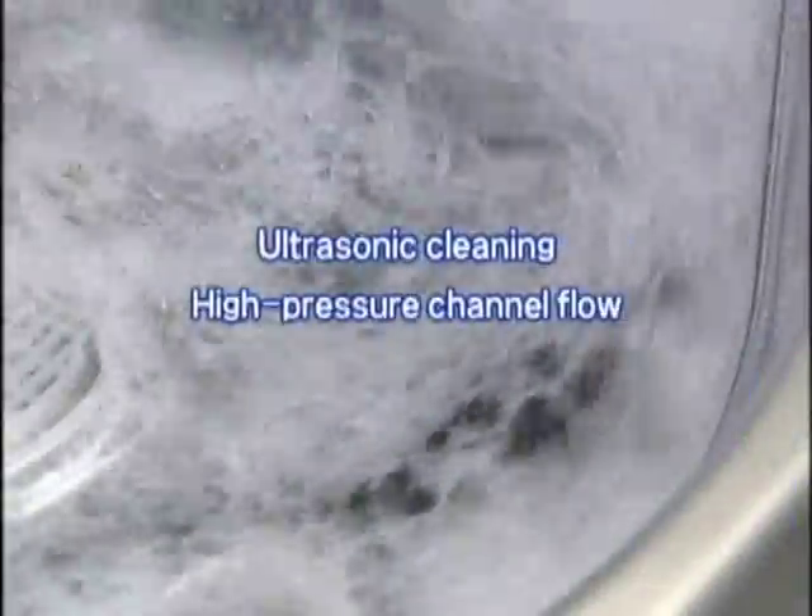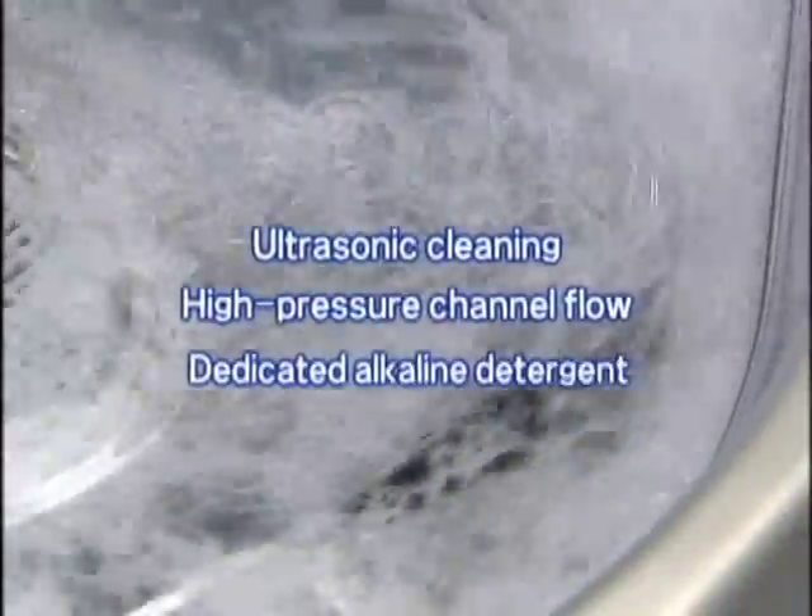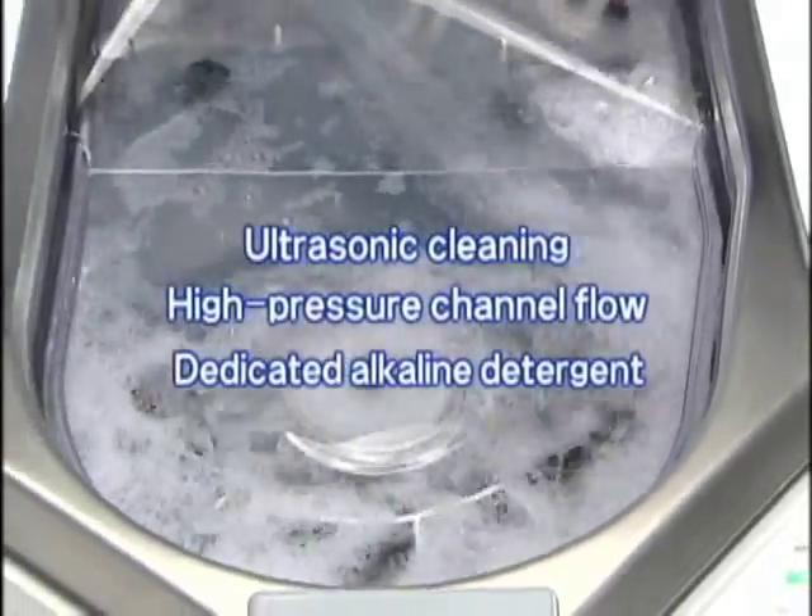Advanced technology including ultrasonic cleaning and high pressure channel flow using a dedicated alkaline detergent further ensures reprocessing reliability.